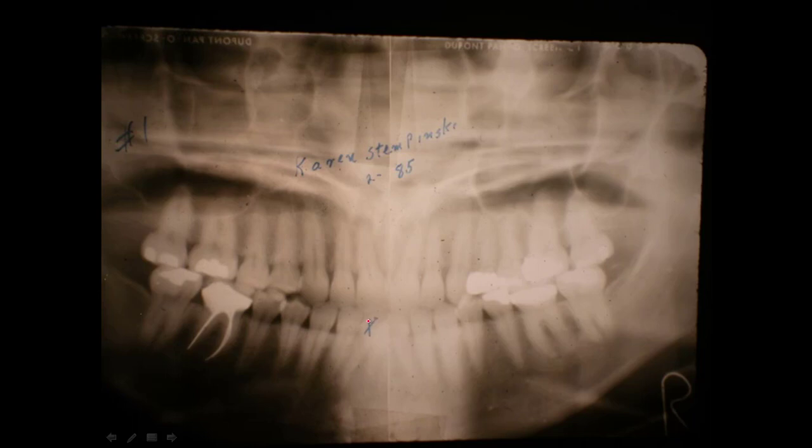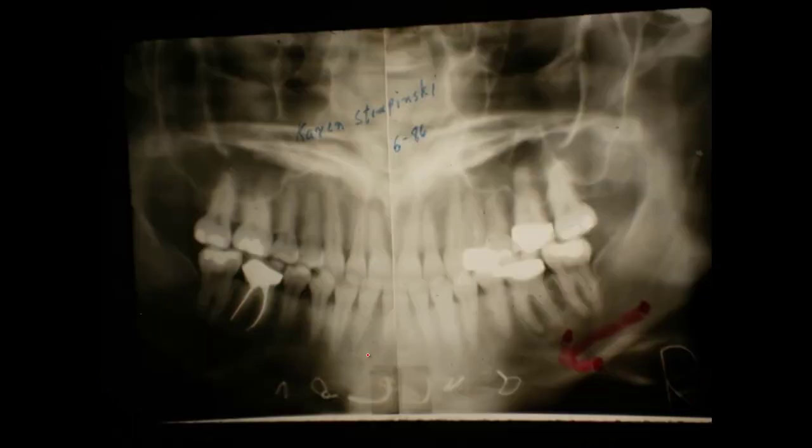And there now they come in and take out this left central right in here, and we'll bring that together. And here we go again. Now you can see the wire structure in there holding that down. And here's the lady after we got through with it. Sorry, this was a long time ago and got a little mess on that slide. But we've got the teeth underneath now, a nice smile line. Now she didn't want the little button out here. I would have left that if I were her, but that was her decision. And so if somebody wants to do it, then you can go ahead and do it, or I tell them, you know, I don't feel it necessary, but some people are very particular about the way they look there.